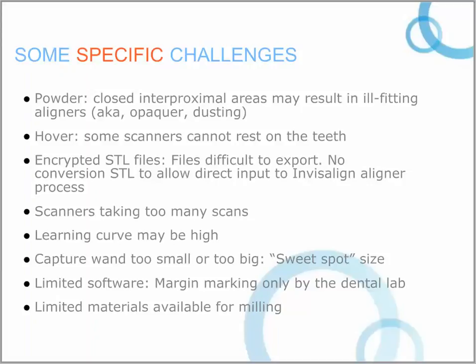The issue of encrypted files. Some of the files that are encrypted are more difficult to export. And encrypted, we all hear and know, and I'm sure you folks out there are much more savvy about encryption than I am, but just know that encryption makes it difficult to send the files, and can make it difficult to send it from one system to another system.